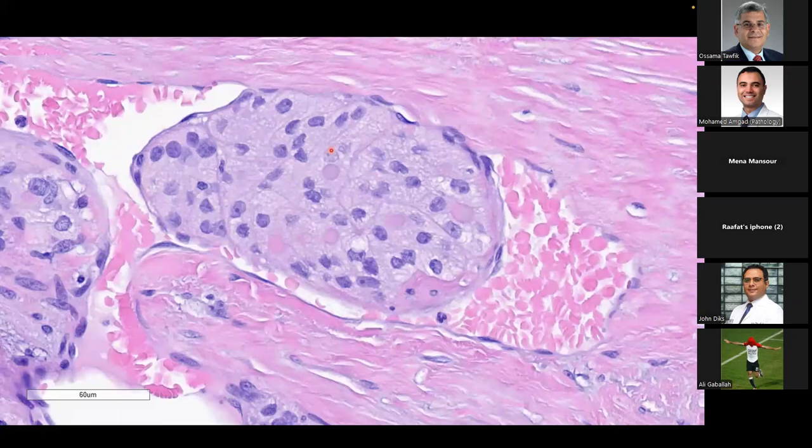These things make it angioinvasion. And this is a nice example of angioinvasion. You can see here the vascular space lined by endothelial cells. And you can see here the thyroid neoplasm going in, and it's wrapped around with endothelial cells. If you can see it, there's a very thin rim of endothelial cells. This is what you call vascular invasion.